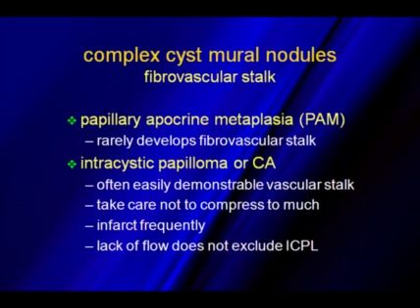The other thing we're going to check for are fibrovascular stalks. So with papillary apocrine metaplasia, rarely will you see any fibrovascular stalk. With your intracystic papillomas or carcinomas, typically we will see fibrovascular stalks.